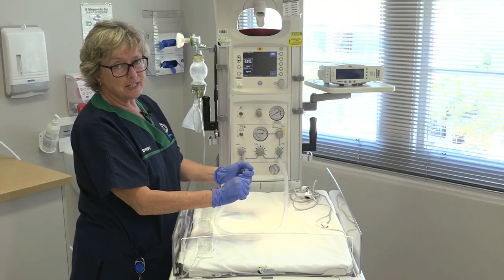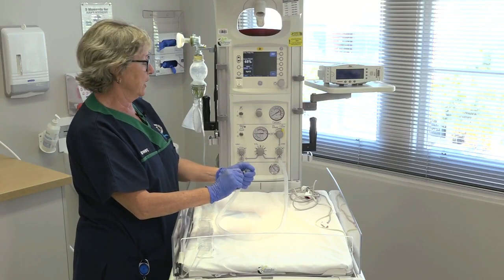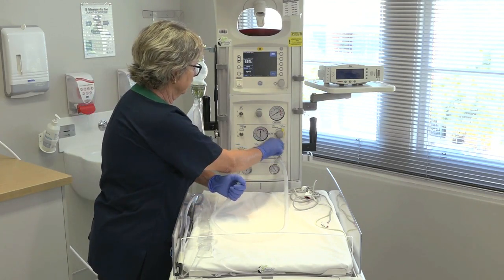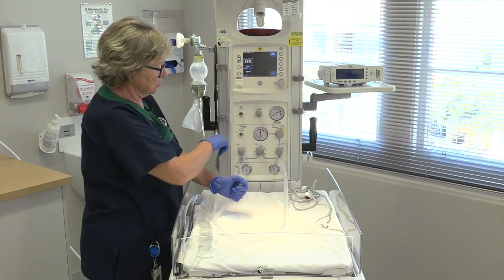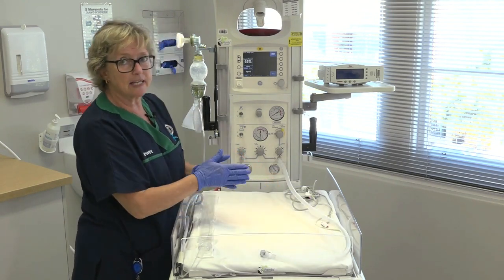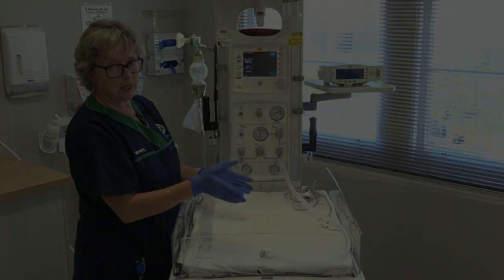If the birth is not imminent, we should turn off the gases to conserve them. We turn off the flow and turn off the toggle switch — everything goes back to zero — and that will conserve our gases for the resuscitation.